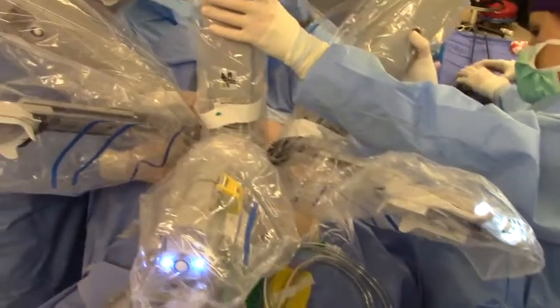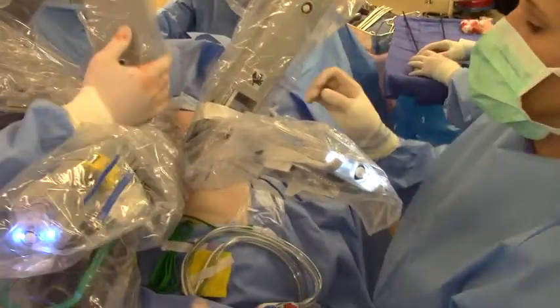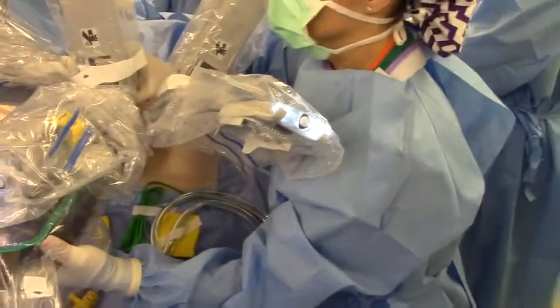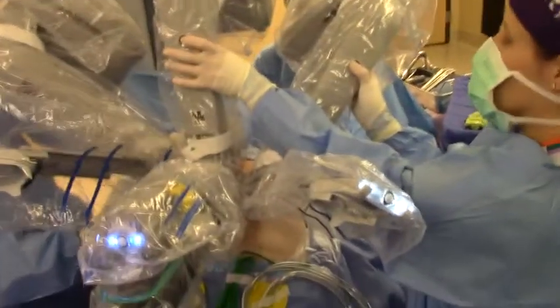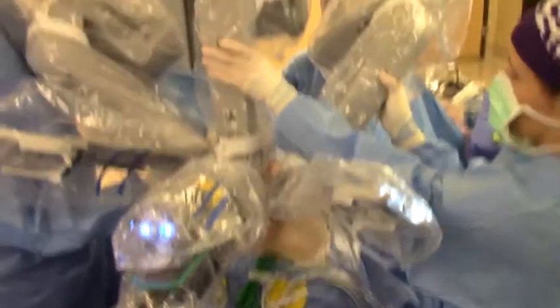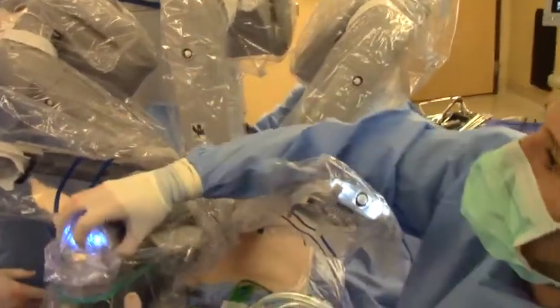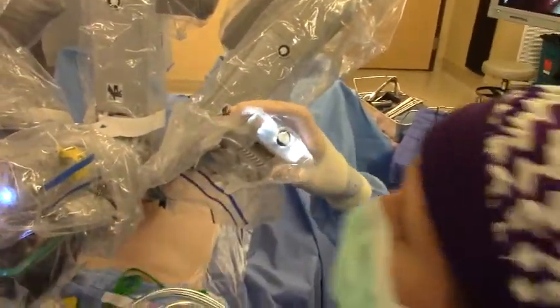It looks like actually we need to come in with the camera a little bit. I've got the trocar — and this one has a remote center line: one, two, three, press, and up. Good. Right there. There's a thin black line on the trocar. It's supposed to be pushed all the way down. So yeah, you can see that.